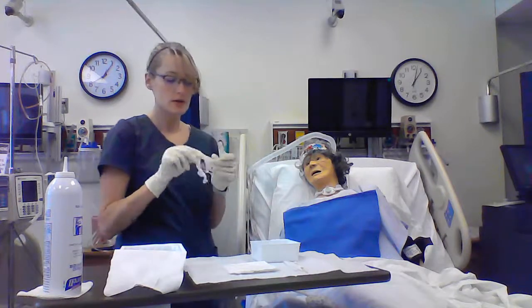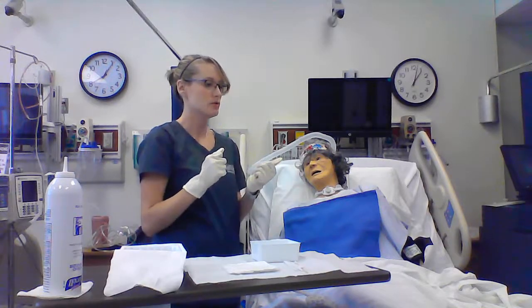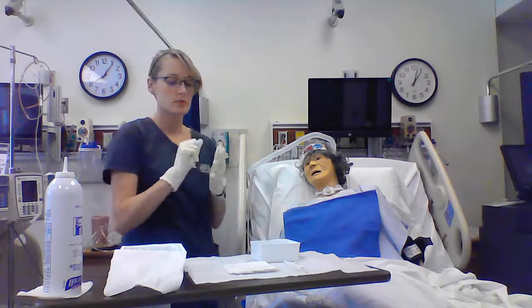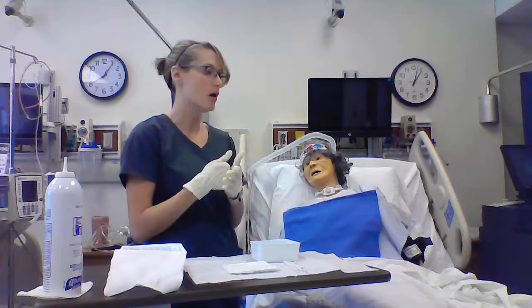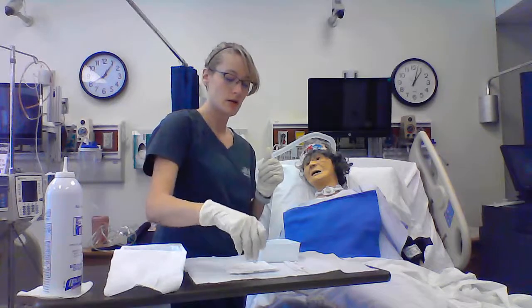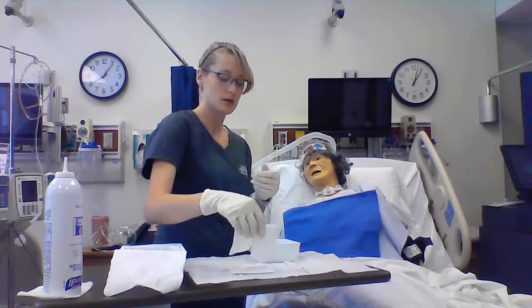So I would take off my gloves. At this point you need to don new sterile gloves. So I would take these sterile gloves off. I'm going to throw that in the trash. I'm going to perform hand hygiene and put a new set of sterile gloves back on and get ready to change her V-sponge for her. So I'm sterile again. I'm going to find her V-sponge in the supplies here.